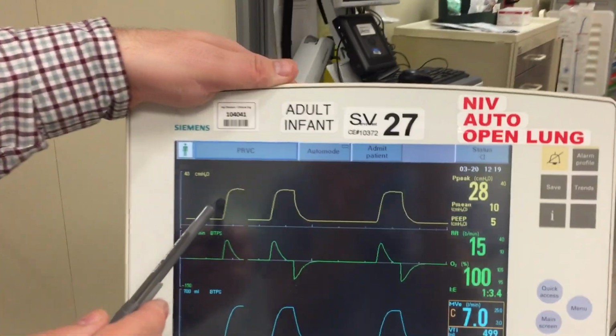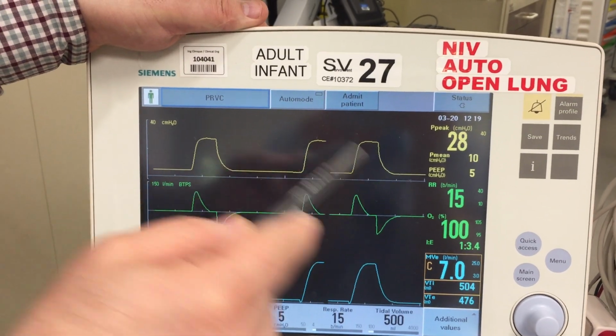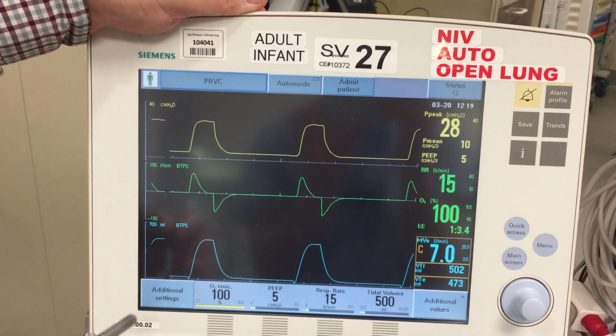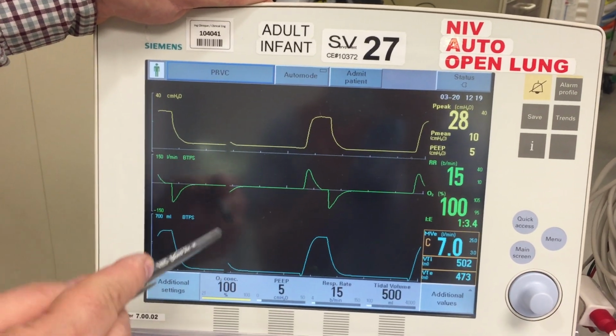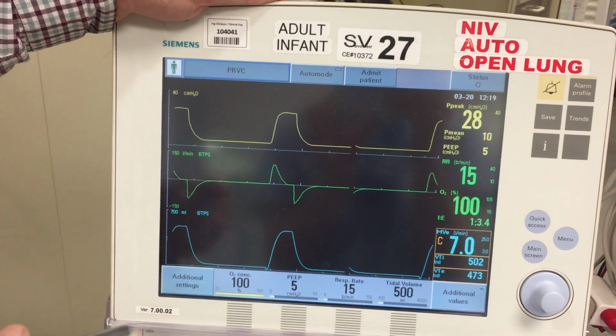Again, going back to the waveforms, this is your pressure waveform up here. Often we should have a nice square waveform, and you can notice that it correlates with a PIP of 28 if we were looking on the scale. There's not a lot to get out of this.